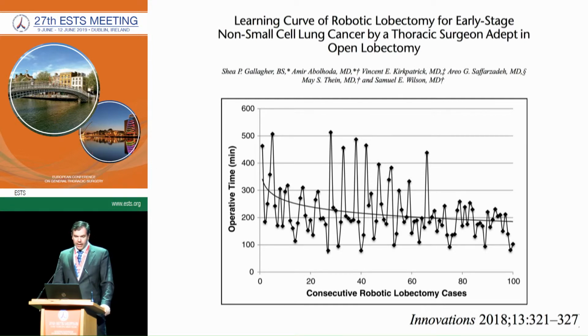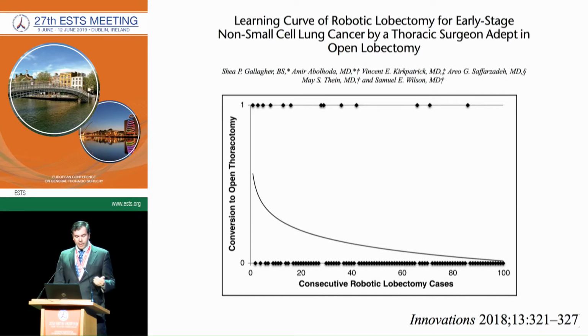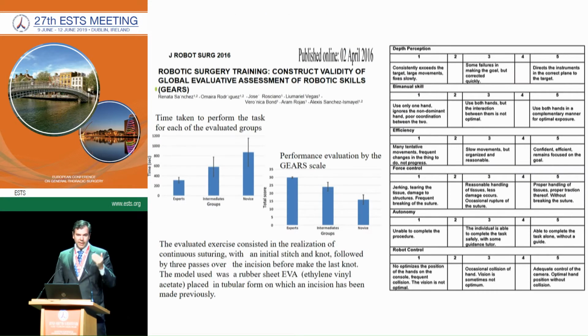Most of the papers that are describing learning curves, like this one, which is a very good paper, just show that the variance decreases over time when you are increasing your experience, as well as the number of conversions. But I think that the most important way of evaluating residents is to have a well-structured strategy or well-structured instrument like GEARS.